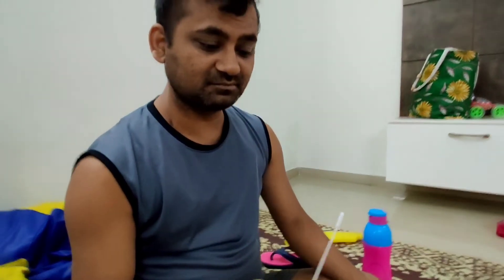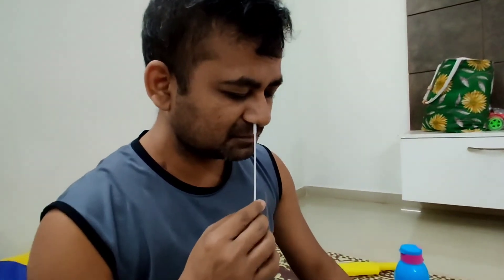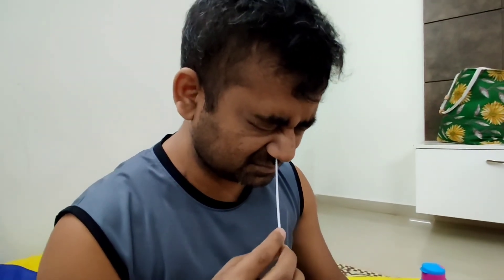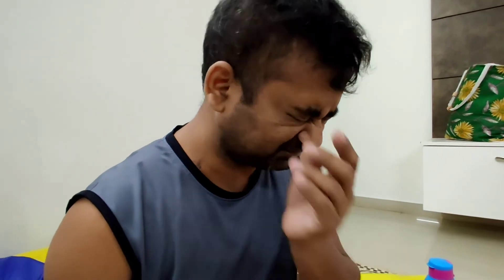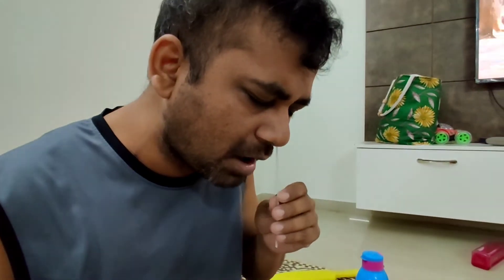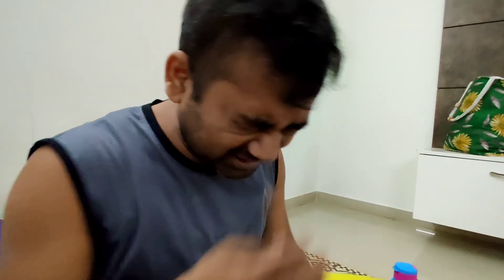Place the swab in your nostrils and rotate it. Now take both sides — this is just the nostril test. Take one side and rotate it five times.